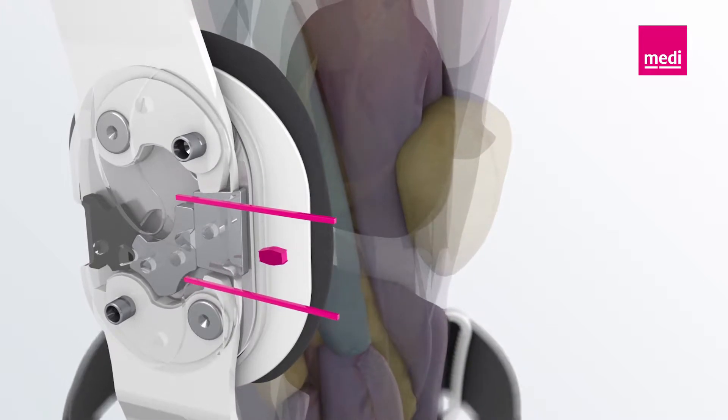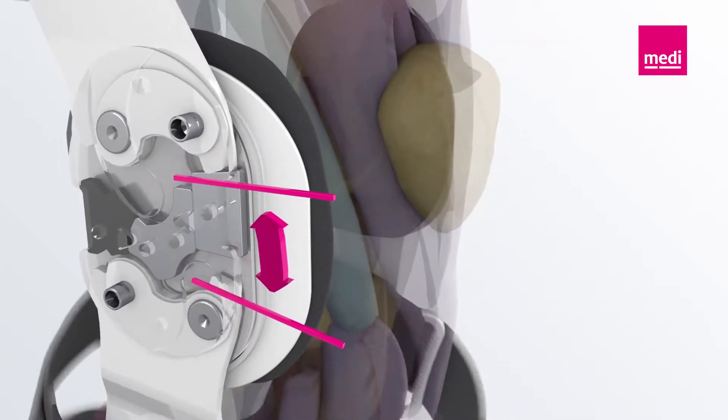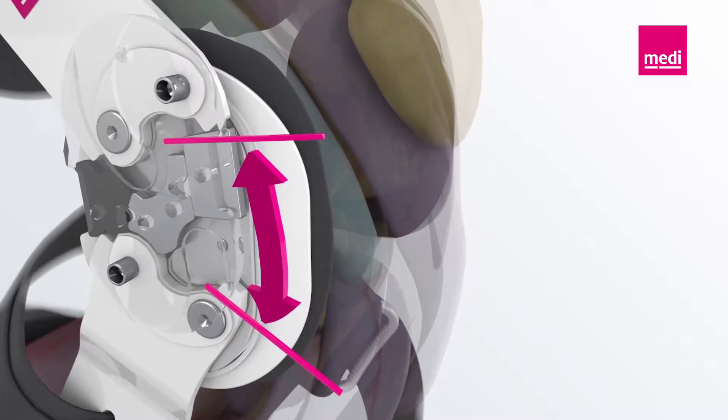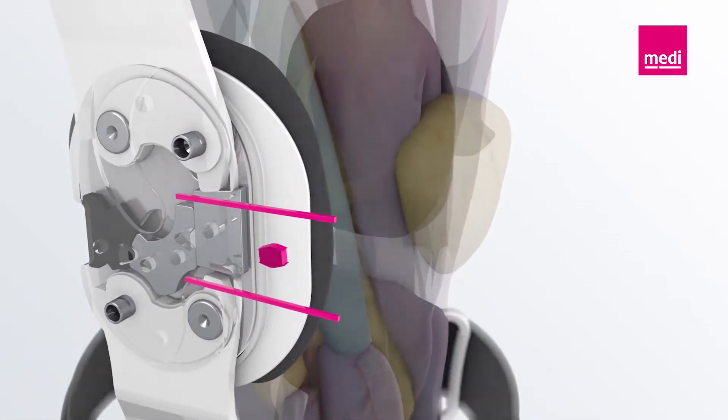The Physioglide joint imitates the rolling gliding movement of the knee joint to guarantee that the orthosis fits perfectly. The additional option of limiting extension and flexion protects the affected knee joint from damaging movements and thus maintains the patient's treatment status.